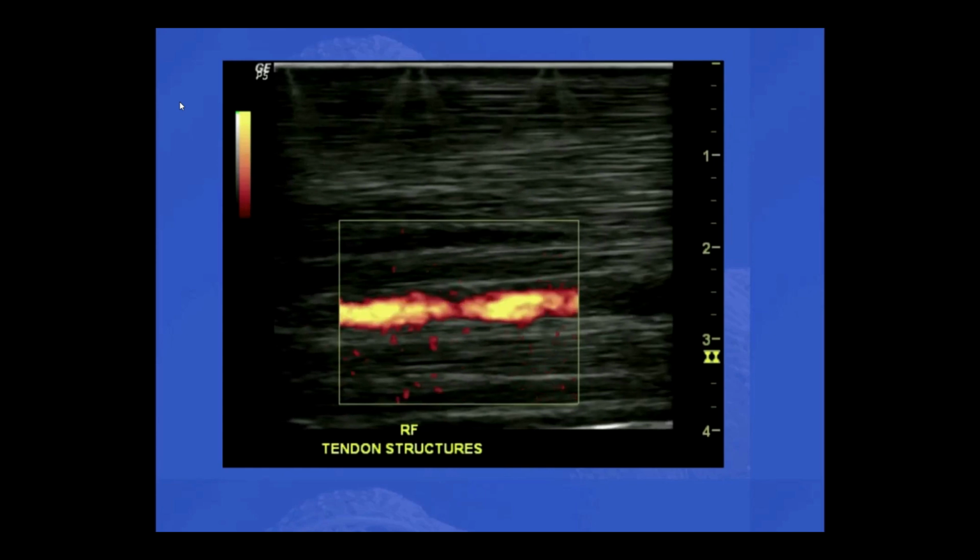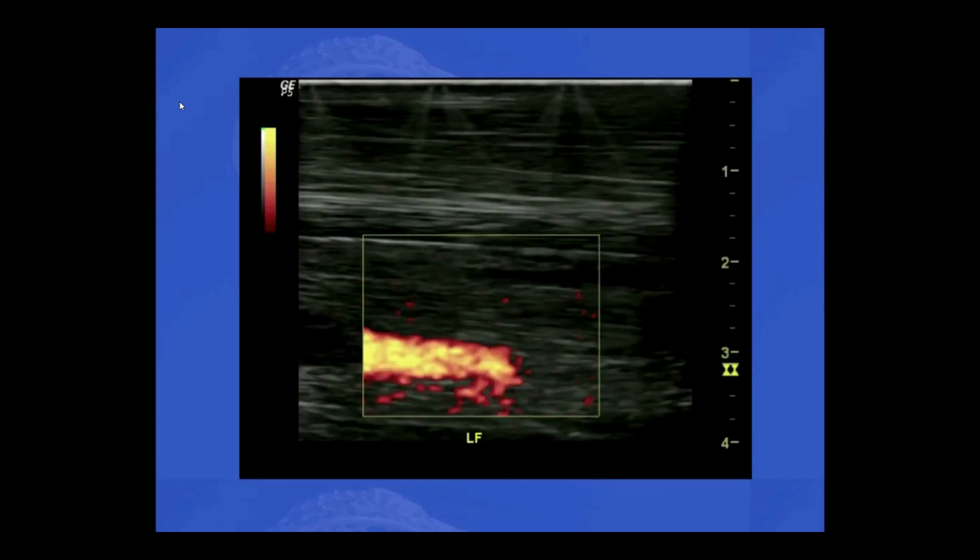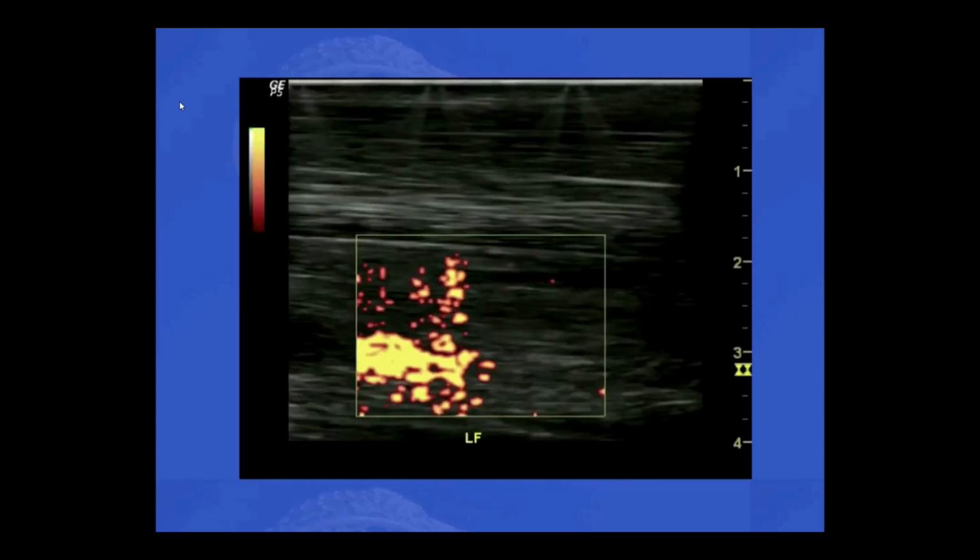This is an image where we just have the standard normal blood flow in a vessel in the lower limb of a horse. And what we could see here is one that showed that effect where your blood flow flashes out in the tissue around it and not just stays in the vessel. So a big difference in what you could see. And if you would look at that with a standard normal Doppler, you would not really see that pattern. It's so much more sensitive to show you that.